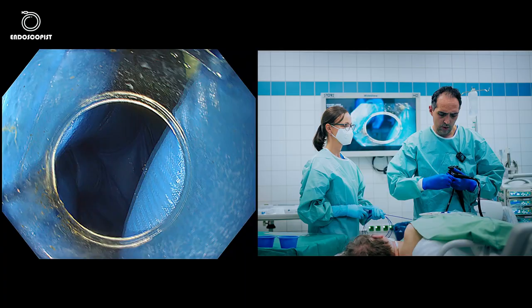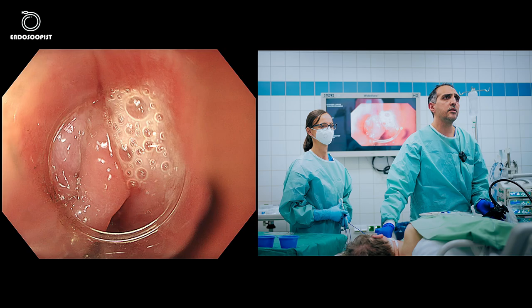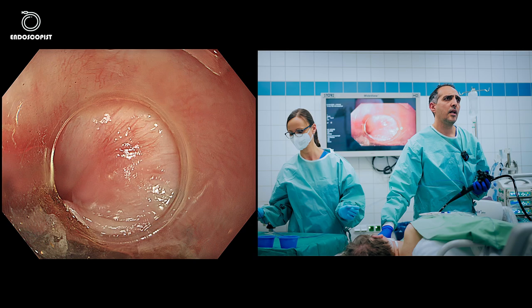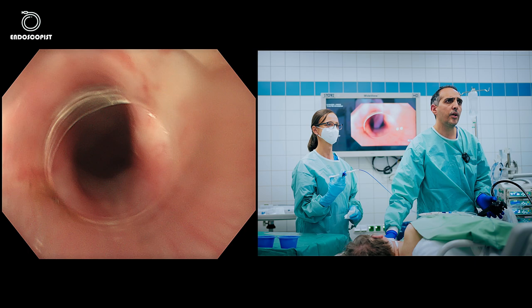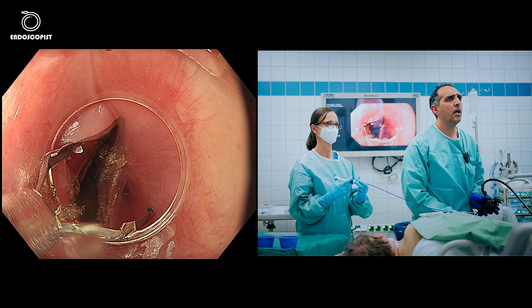The upper sphincter is now quite open — the difficulty we had at the beginning is gone. With just gentle pushing we can go inside. I'll draw the scope and try to find the upper border of the incision. It's quite a tight space, but we're doing our best. Usually we need around four to five clips to close such tunnels.